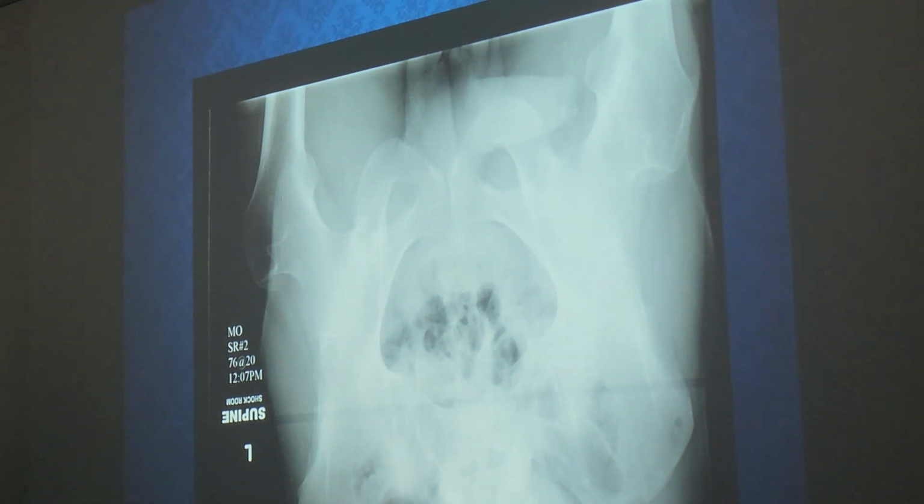Some examples of what not to do. An upside down pelvis, and then we have some upside down annotations and a marker. An upside down marker would be an unacceptable image. That is not something we want to call optimal.